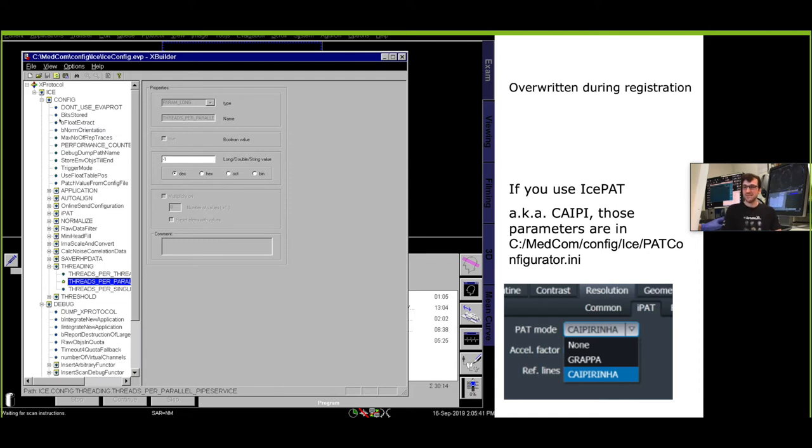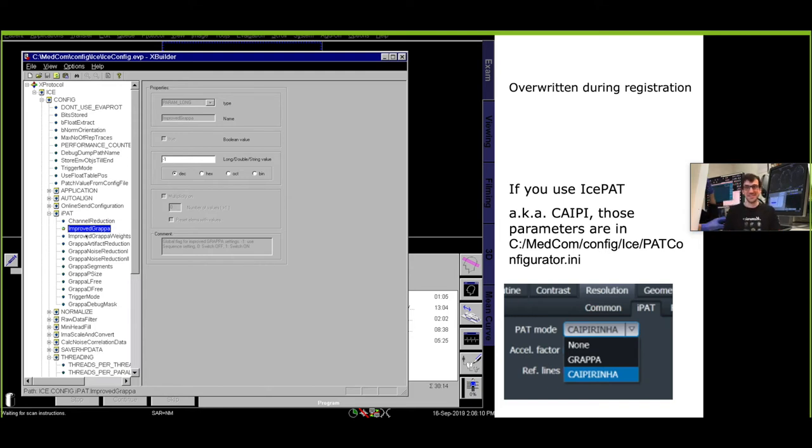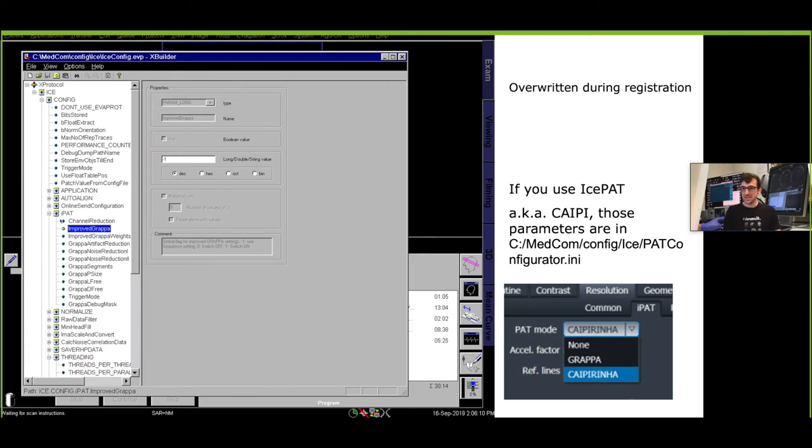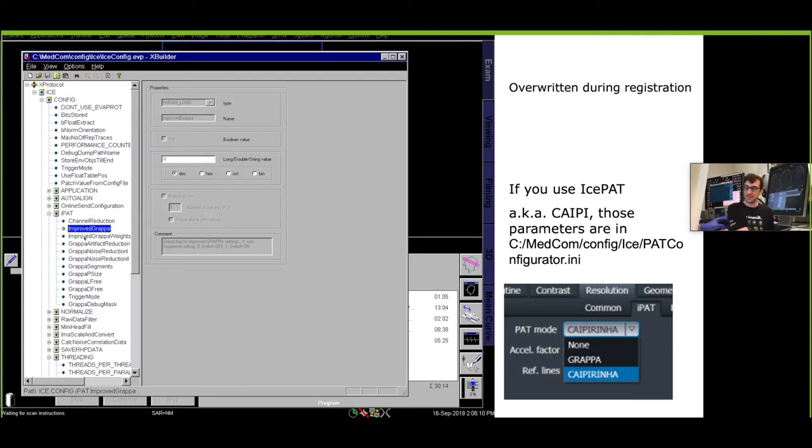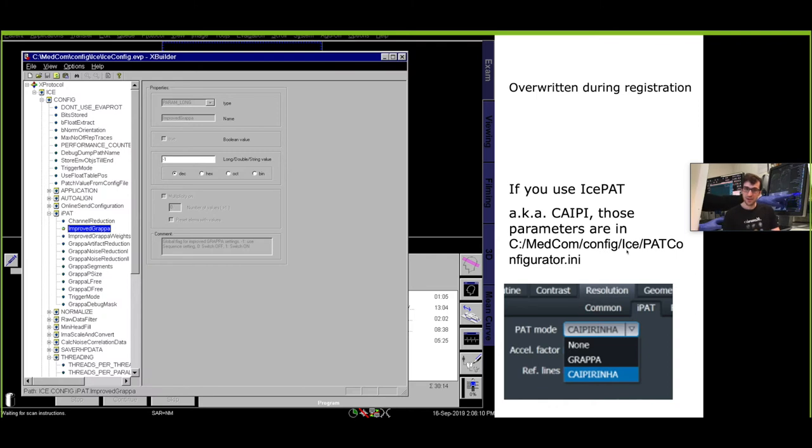Within this editor there are a lot of fields. Specifically within here, Ice Config iPAT, there is this parameter called Improved GRAPPA which even though it's improved and I think it's improving, it's named improved and still it's switched off by default. So the first thing I do is switch that on. Note that all the parameters here within the iPAT are only used when you use iPAT. For example, when you use a different acceleration method like CAIPIRINHA, these parameters are not used. The parameters to optimize the reconstruction in CAIPIRINHA are instead written in the file here MedCom Config Ice PAT Configurator.